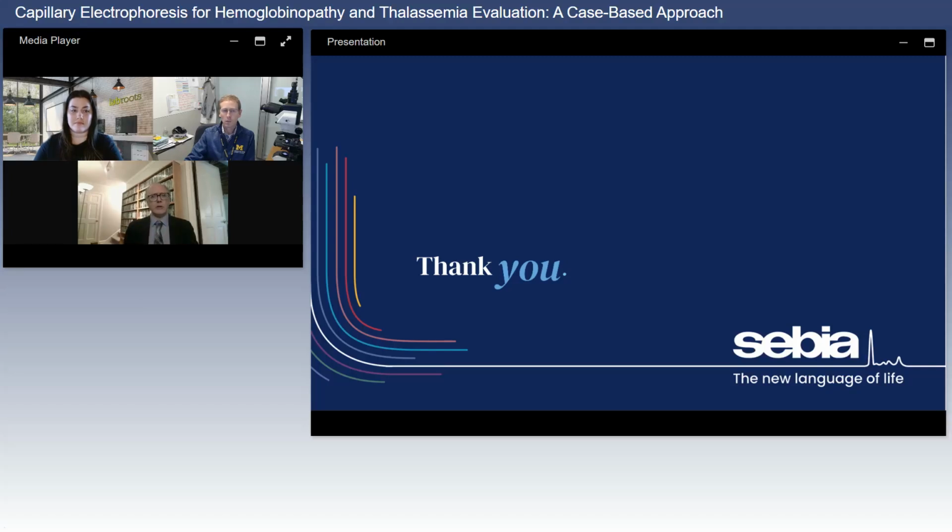Am I right about that, Mark? Are you aware of the close migration of S and D on HPLC, or are they more separated? You know, my familiarity with HPLC is limited, and I'm not sure. Of course, E runs with A2, but I'm not sure where D runs. I'm sorry, I can't help.